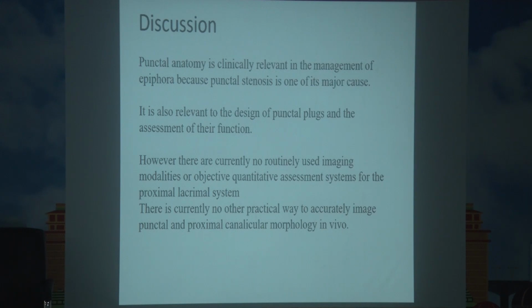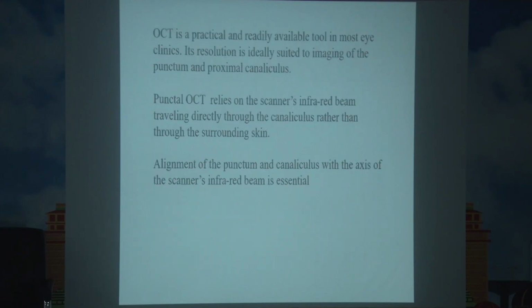Punctal anatomy is clinically relevant in the management of epiphora because punctal stenosis is one of the major causes. It is also relevant to the design of punctal plugs and assessment of their function. However, there are currently no routinely used imaging modalities or objective quantitative assessment systems for the proximal lacrimal system. There is currently no other practical way to accurately image the punctum and the proximal canalicular morphology in vivo.